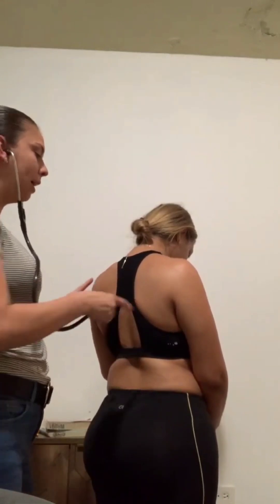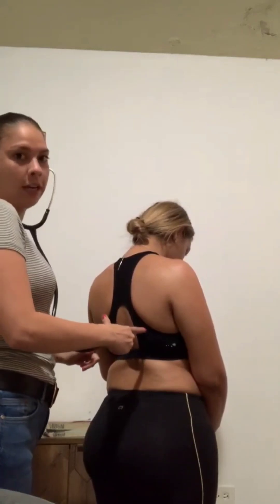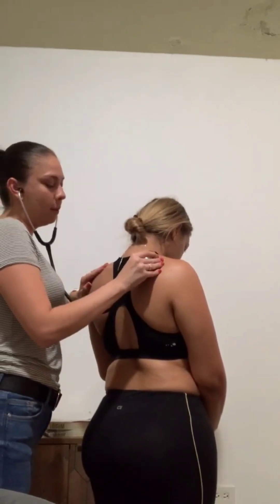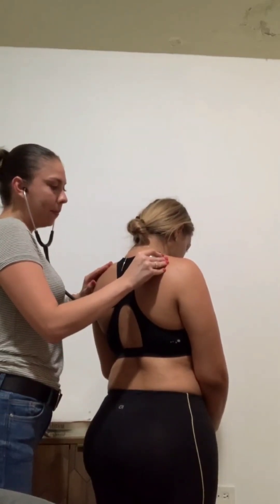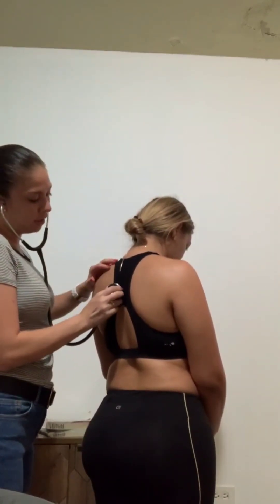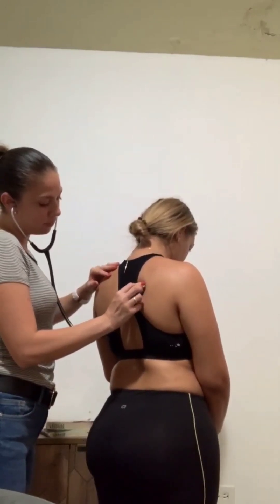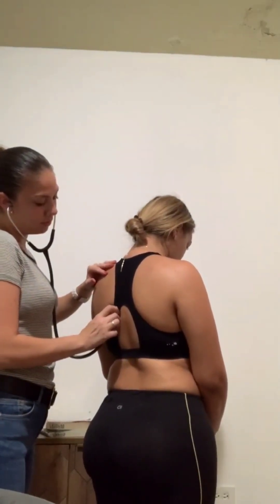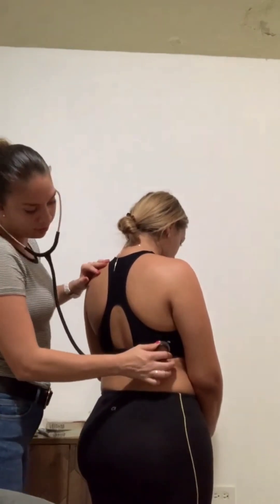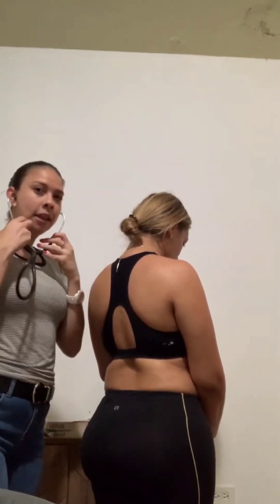When I'm auscultating on her back, because her scapulas are here, I want to make sure that I'm auscultating away from them — not on top of them. So again, we start up here, breathe in and out. In and out. And then right above here — and then out. And then out.